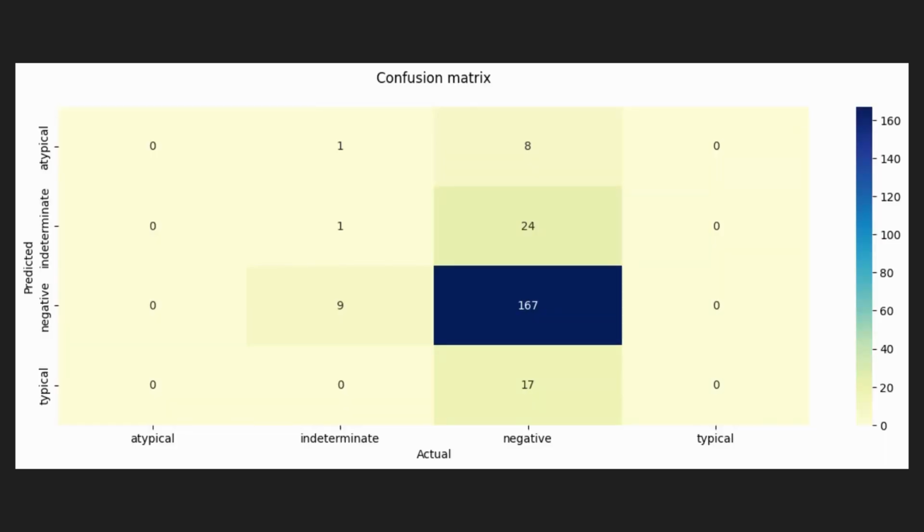As you can see, this confusion matrix from our early phase of work on the project has nearly all predictions as negative. With so much negative data, the model predicts negative nearly every time. This can be deceiving, as the model accuracy associated with this matrix is around 75%, despite the model not producing any meaningful results. Luckily, our pre-processing pipeline helped to address this imbalance, along with many other aspects of the data.